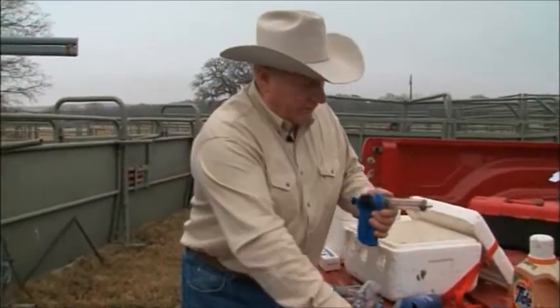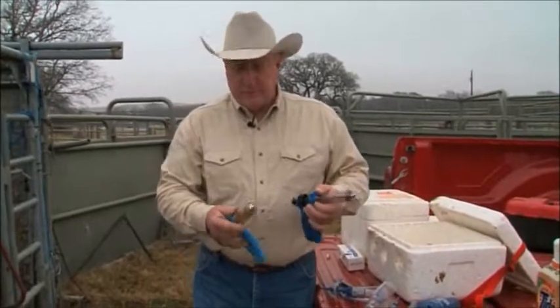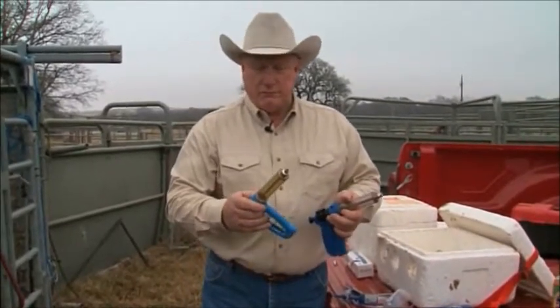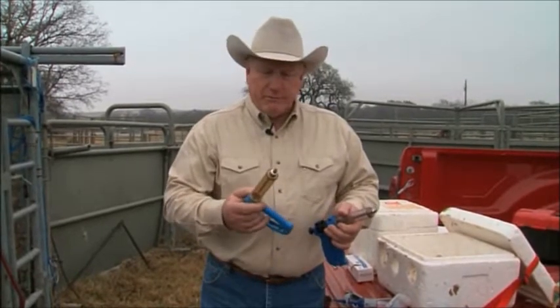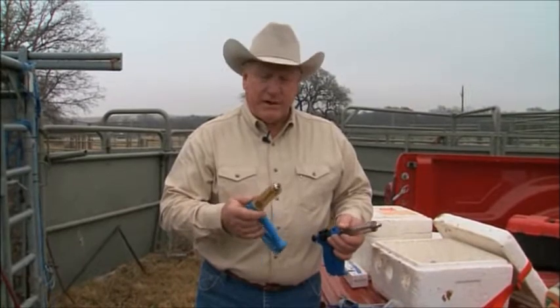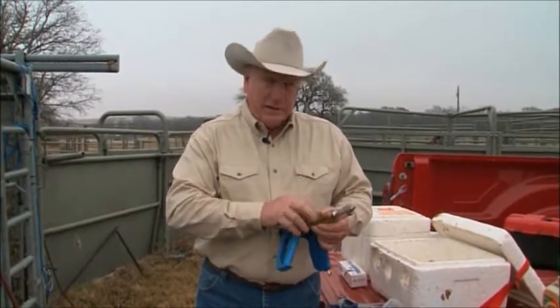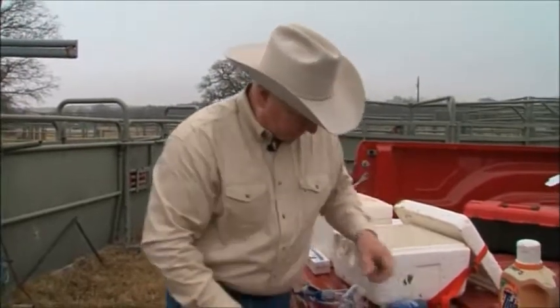Now you notice this syringe has somewhat of a clear barrel, a little older design. This one has more of an opaque barrel, and it will keep some of the ultraviolet light out. But a lot of people are mistaken in thinking that's safe, because the heat and cold will still damage vaccine if left out in it. Sunlight, not so bad, but once again, use those as they should be as well.